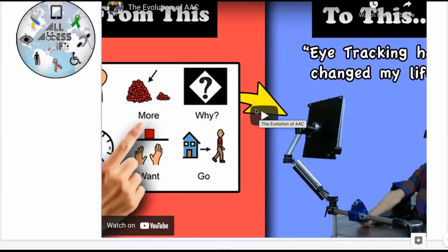They're not sweating, there's not perspiration on their brow, they're not holding themselves and holding their breath to really be able to perform the movement that they need to direct access or to access with their switch. So that's definitely a plus in that area.